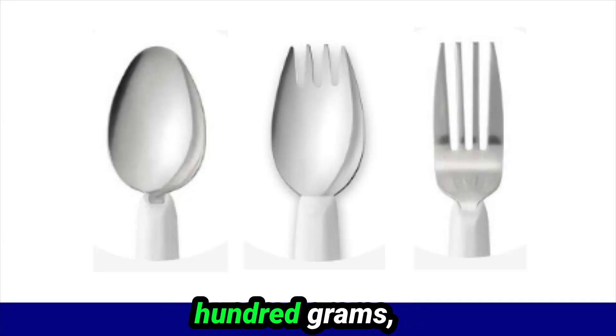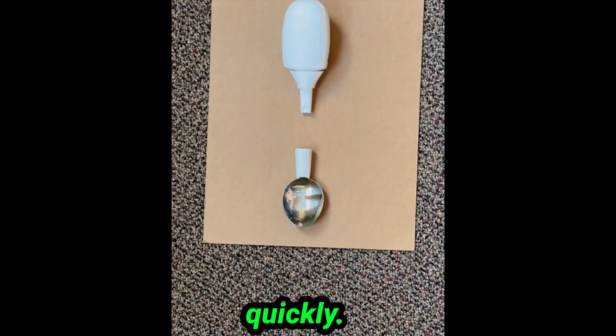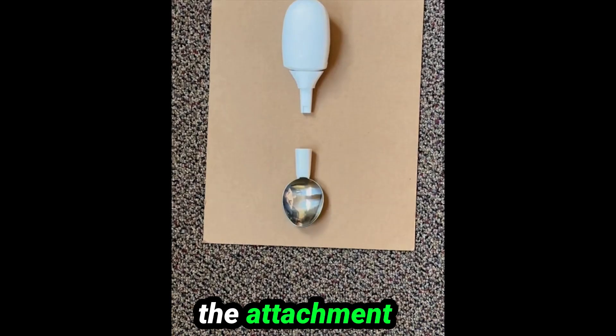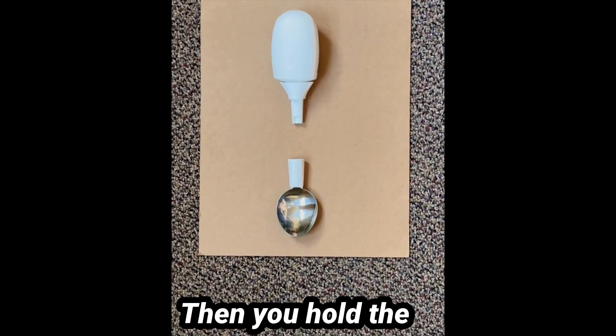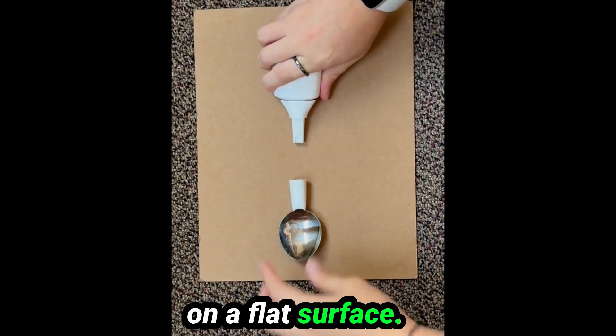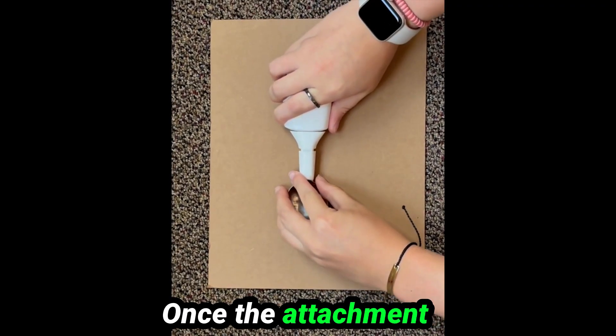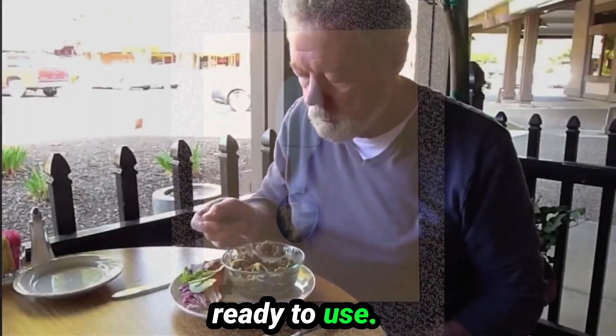The Liftware Steady silverware weighs about 100 grams, which is less than weighted silverware. The silverware can be assembled quickly. First, you grab the handle and the attachment you want to use — this is the soup spoon attachment. Then you hold the handle in one hand and the attachment in your other hand on a flat surface. Push them together until you hear the click. Once the attachment is on the handle, it will turn on and then it's ready to use.